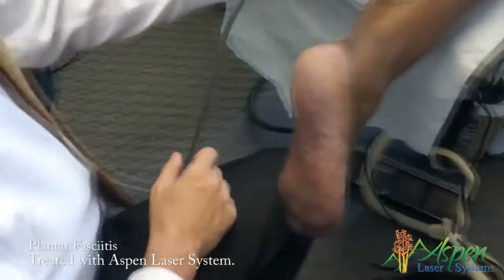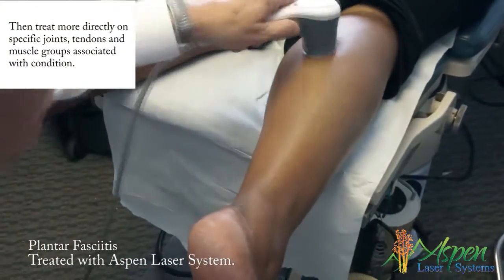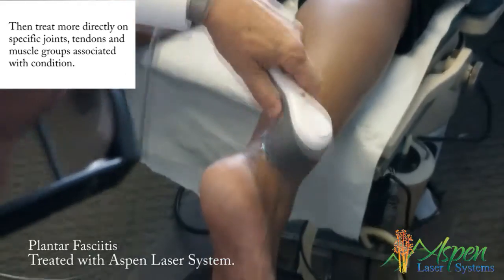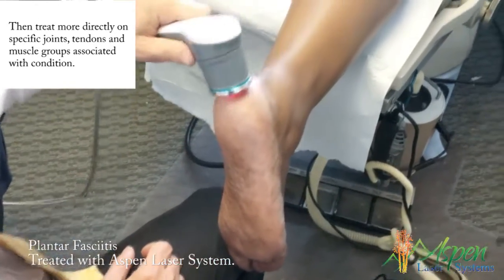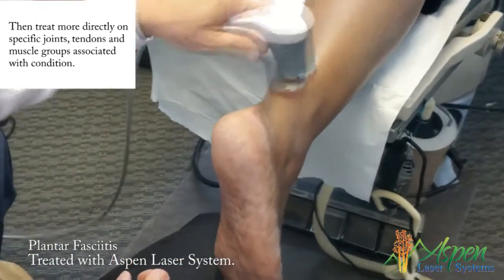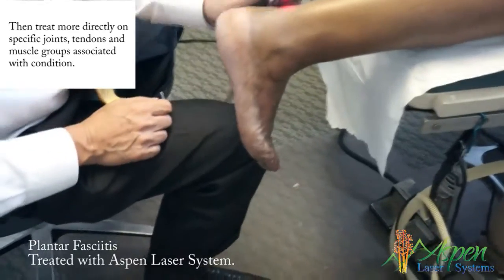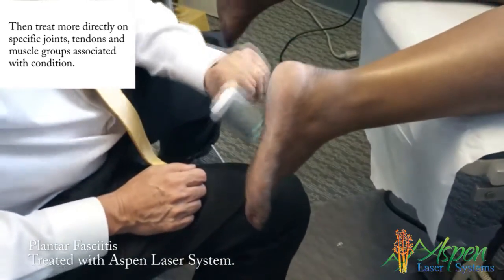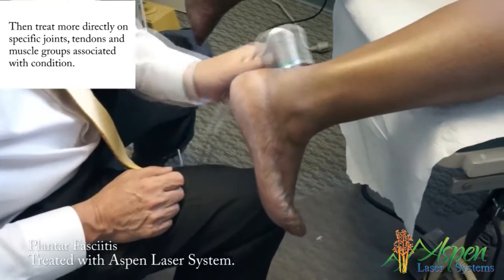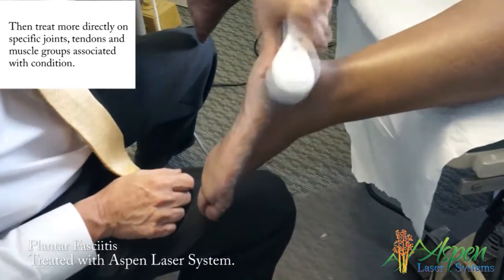It should be very relaxing. I'll do the peroneal longus and brevis. Come around here — just slowly move your foot up and down, back and forth towards you and away, slowly. If it hurts, we don't have to do it. It should feel like it's getting looser over time — in about a minute it'll get looser. The joint mobility improvement is amazing.